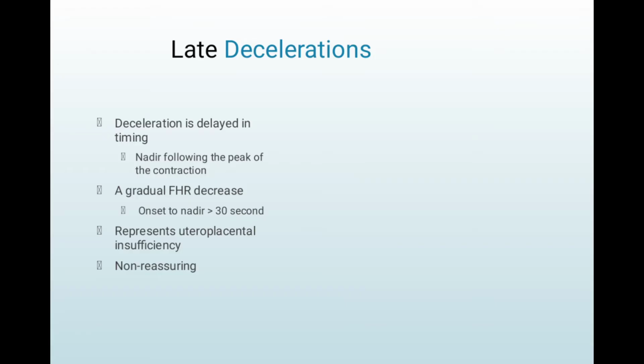Late decelerations are delayed in timing, with the nadir following the peak of the contraction. It is a gradual fetal heart rate decrease, with onset to nadir of 30 seconds or more. It represents uteroplacental insufficiency and is non-reassuring.